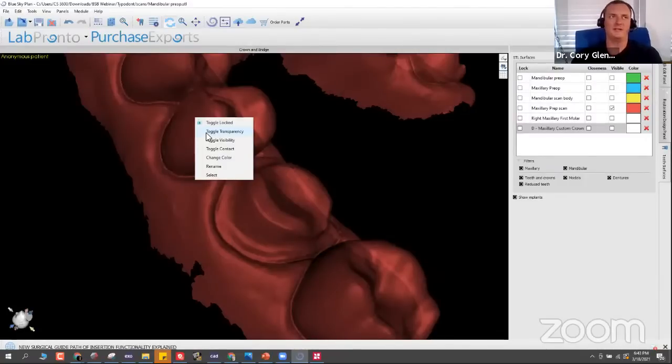Where you can't necessarily scan impressions is with full arch impressions, because just think about it. If you look at an impression and you can't readily see every surface of every tooth, the scanner can't either. You've usually got anterior teeth that are inclined plus a labial fold that's kind of hiding them. And so usually a desktop scanner, if you're just scanning an impression, is going to miss the lingual areas of those teeth. Same with really long teeth, it's trying to get the scanning light down into a deep, dark hole, and so it might not be able to. But again, for posterior teeth and for triple trays where everything is oriented straight up and down and it's not that deep, I've actually never had a failure on a triple tray that I can recall. So it really is an easy process for your single tooth day-to-day crowns.